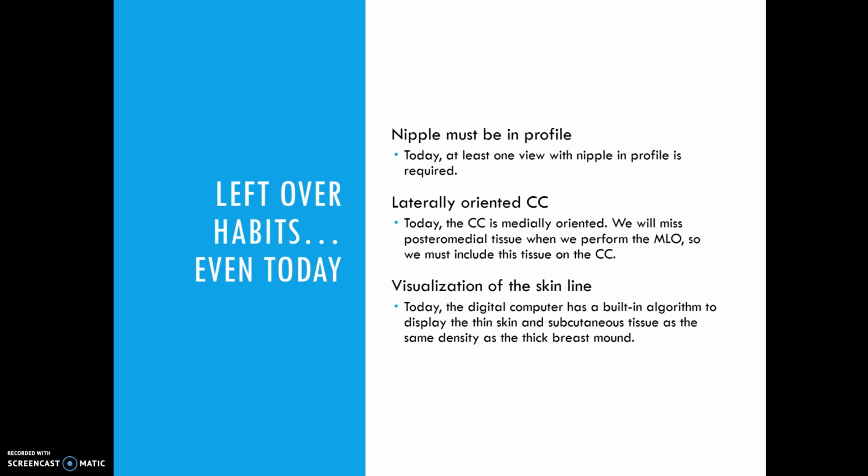But with all of our old techniques, especially with xeromammography, we have a lot of leftover habits. And one of those is that the nipple must be in profile. Today, only one of the views will need to have the nipple in profile, because depending on the shape of a woman's breast, or if she has post-surgical changes in her breast, you may not be able to get that nipple in profile and still get as much breast tissue in the image as possible.